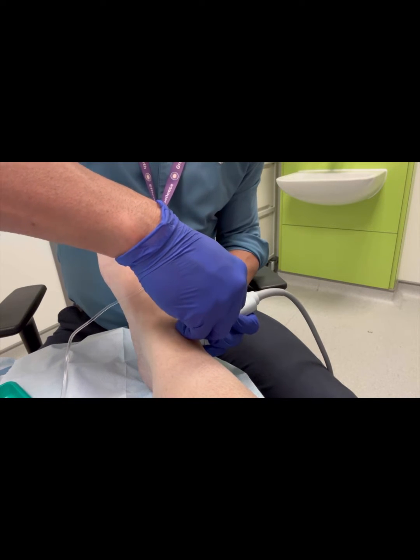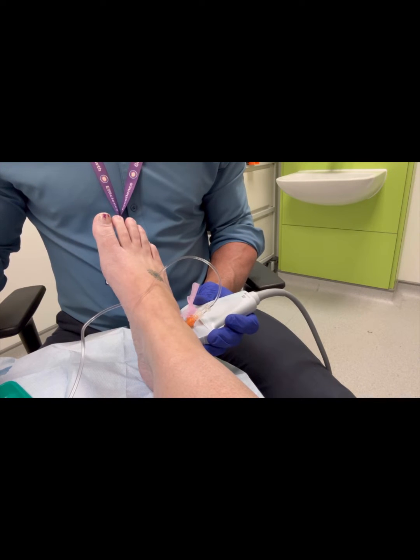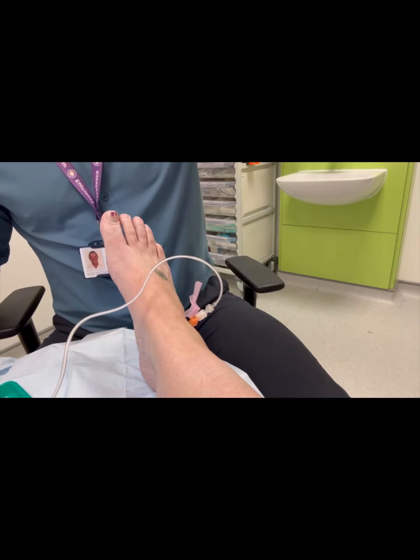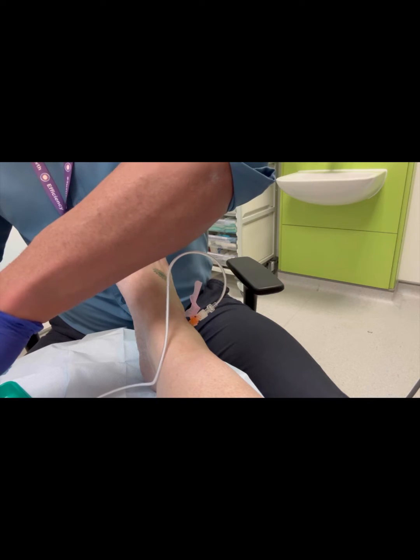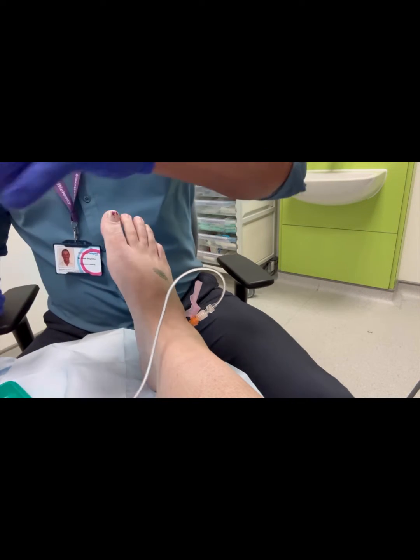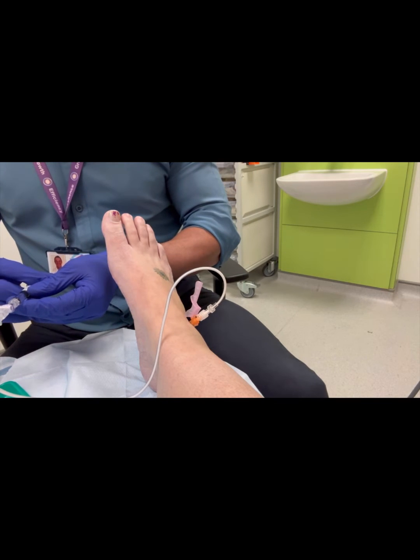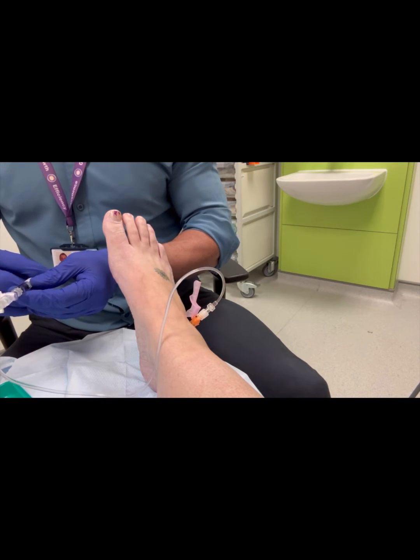This is a slightly more complex injection to perform. I am ensuring accurate needle placement using ultrasound guidance. The needle placement is usually within the sinus tarsi, which is usually a comfortable position to place a needle.